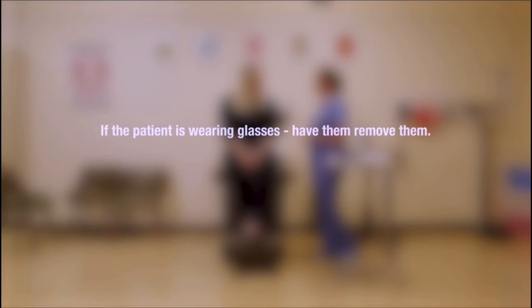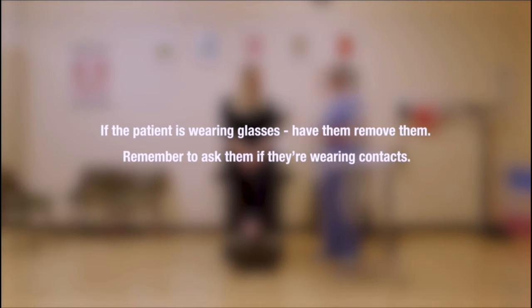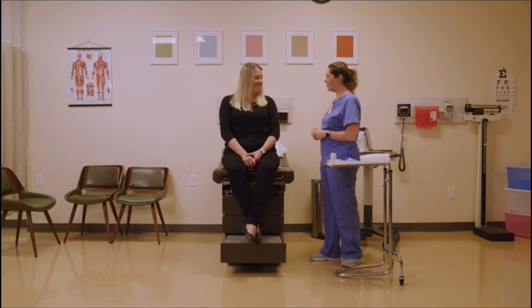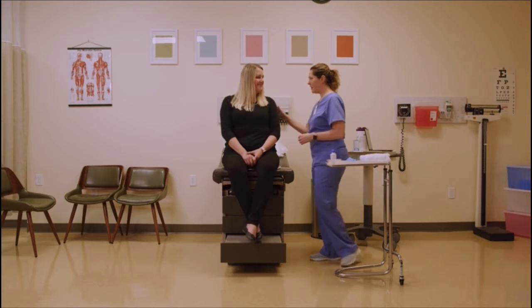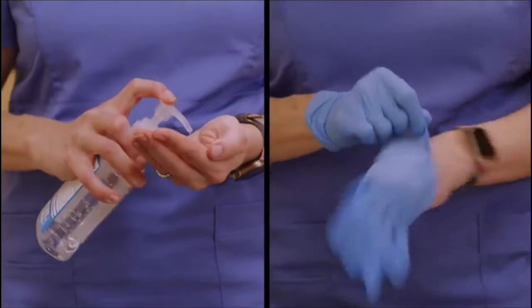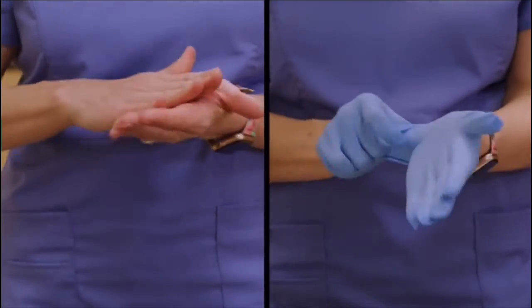If the patient is wearing glasses, have them remove them. Remember to ask them if they're wearing contacts. If so, ask them to remove them. Ask the patient if they'd like to sit or lie down during the procedure. Position the patient based on their preference, in either a sitting or supine position. Perform hand hygiene and apply non-sterile gloves.